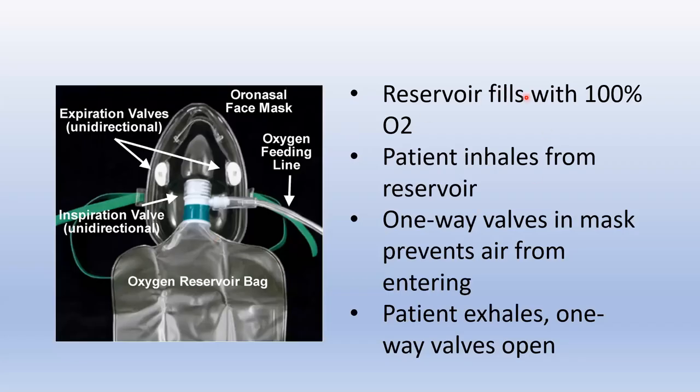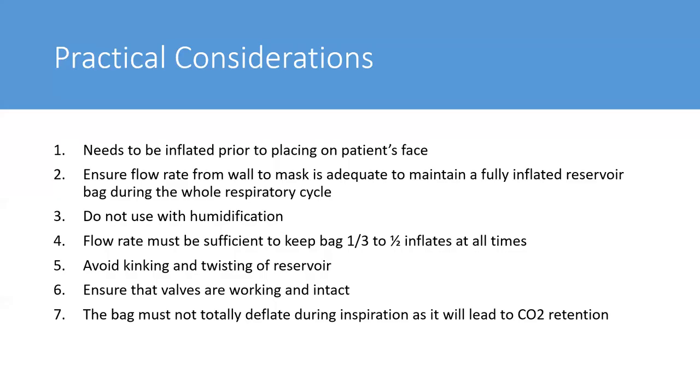So basically then, the reservoir fills with 100% oxygen. The patient inhales from this device, from this reservoir, I should say. There is a one-way valve in the mask right over here, which prevents air from entering from the atmosphere. However, this valve opens only on exhalation. So as the patient breathes out, this will open up, allowing therefore for the carbon dioxide to exit. So there are practical considerations in the use of this device.